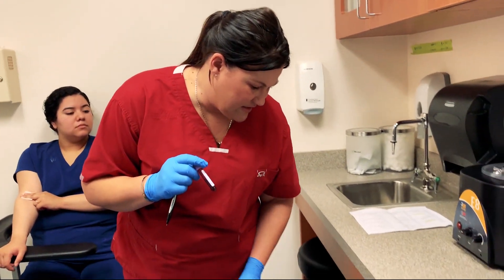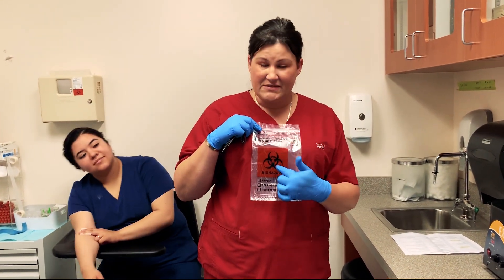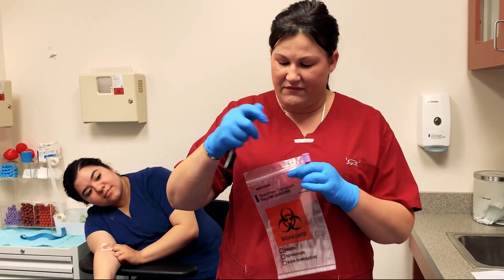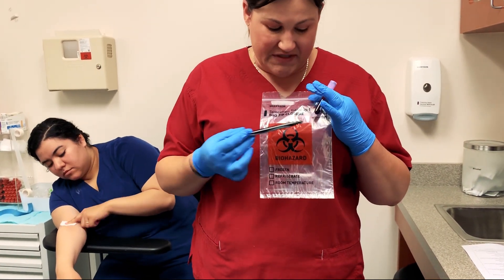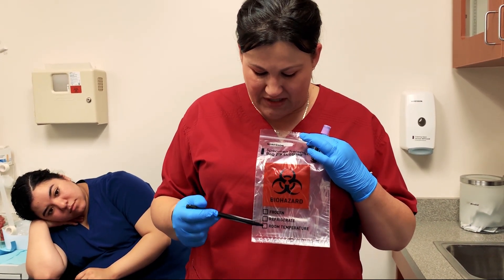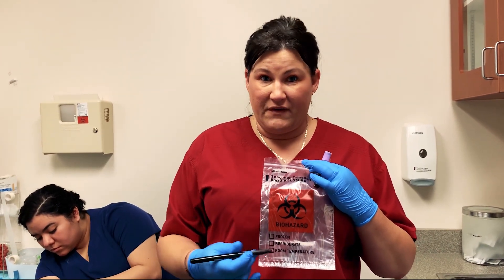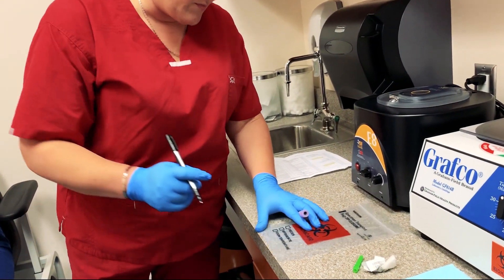So the next thing is to grab your biohazard bag — this is important. You need to make sure that it has the biohazard symbol on it, because you are transporting biohazardous materials. You want to make sure that any applicable boxes on the bottom of the bag are checked. This is a pretty standard EDTA tube, so it does not need to be frozen or refrigerated — it can go at room temp. I'll go ahead and check room temp there.